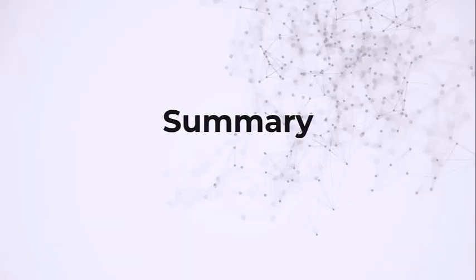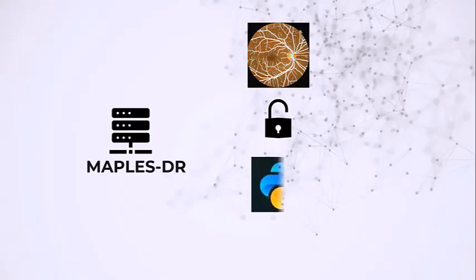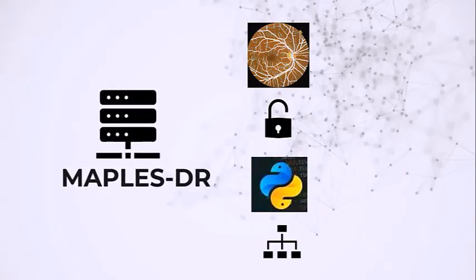In summary, even though MAPLES DR is a small dataset, pixel-level expert annotations, open accessibility, a ready-to-use Python package for loading and processing of data, and clear structure with rich metadata make it a powerful dataset for explainable medical AI and easy to use.